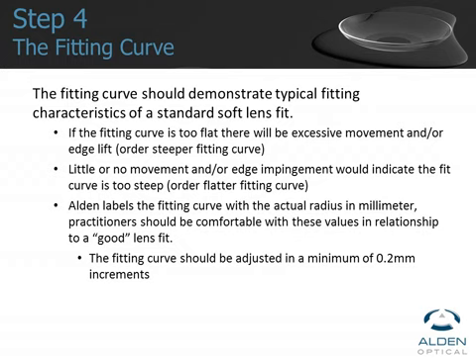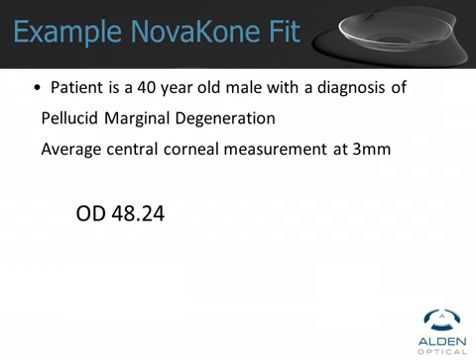If you're seeing too much, order a steeper fit curve. In the other direction, if there's little or no movement, or maybe you're even starting to see a little edge impingement, it would indicate that we need to order a flatter fit curve. We want you to change that by at least 0.2 millimeters to make a difference. And then go ahead and determine which fit curve you want to go with.